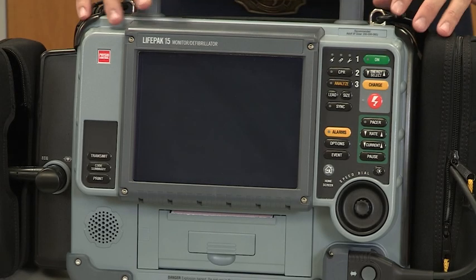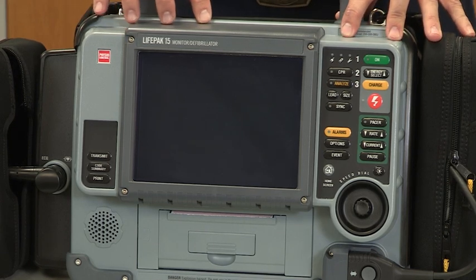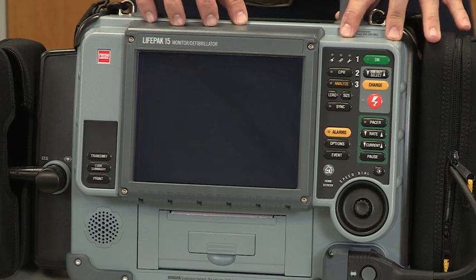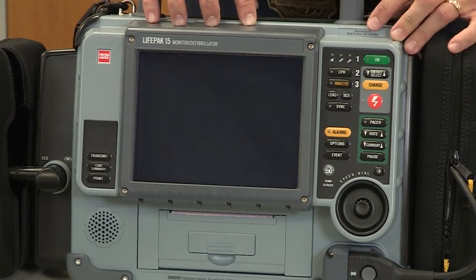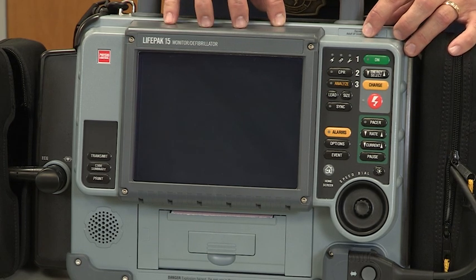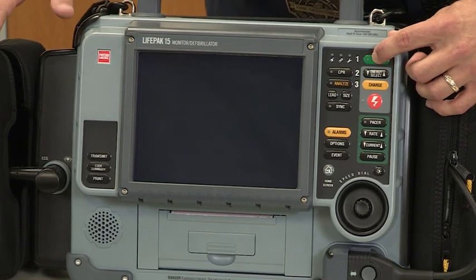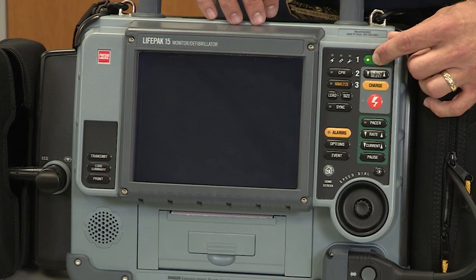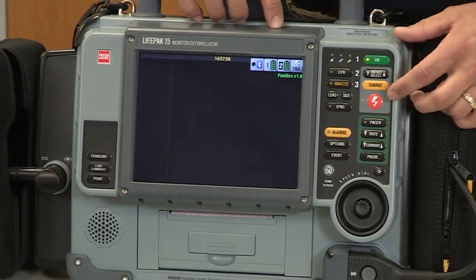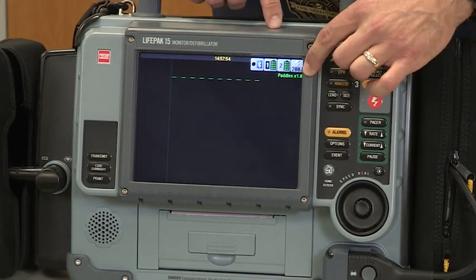Okay, now we're going to get into the operation of the LIFEPAK 15. Again, a lot of this is review because the functions and the buttons are very similar or identical to the LIFEPAK 12 that you are currently using. The LIFEPAK 15 will also be set up with all the same defaults as the LIFEPAK 12. We're going to start with the 3-lead operation. I'm going to turn the machine on, and just like the LIFEPAK 12, you'll notice that the LIFEPAK 15 is set to come up in paddles mode.